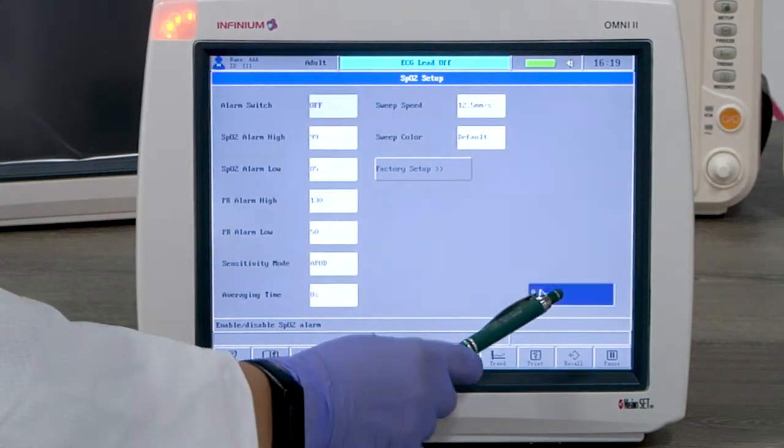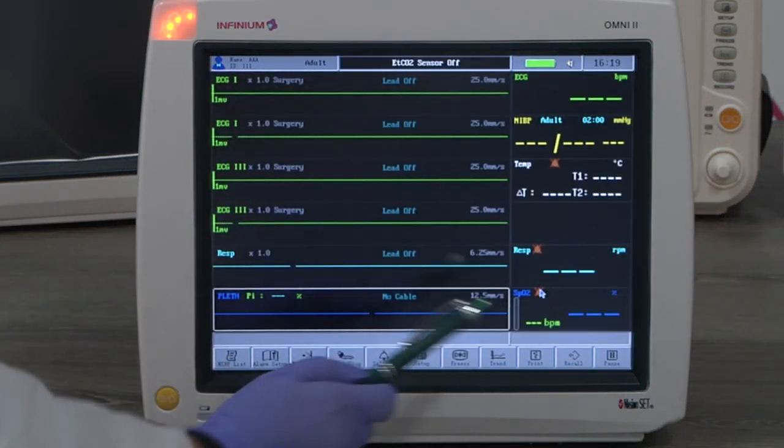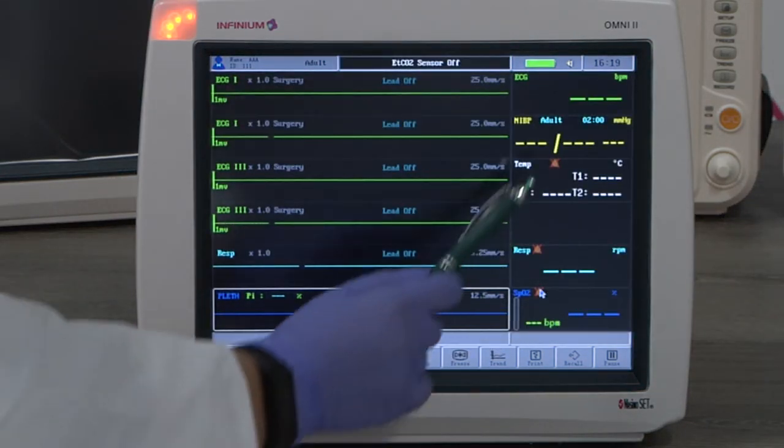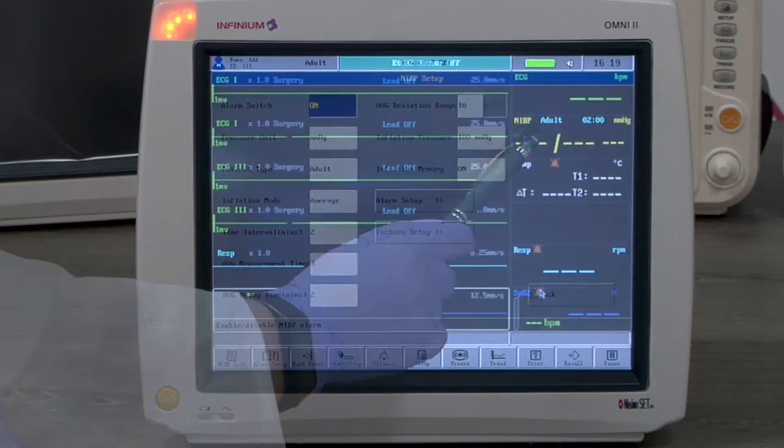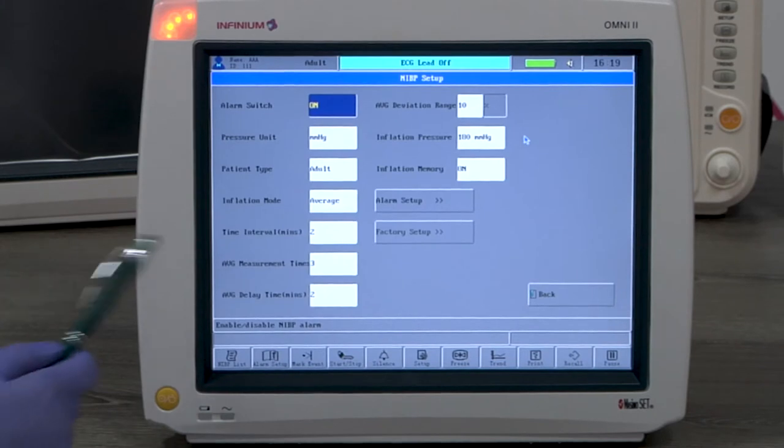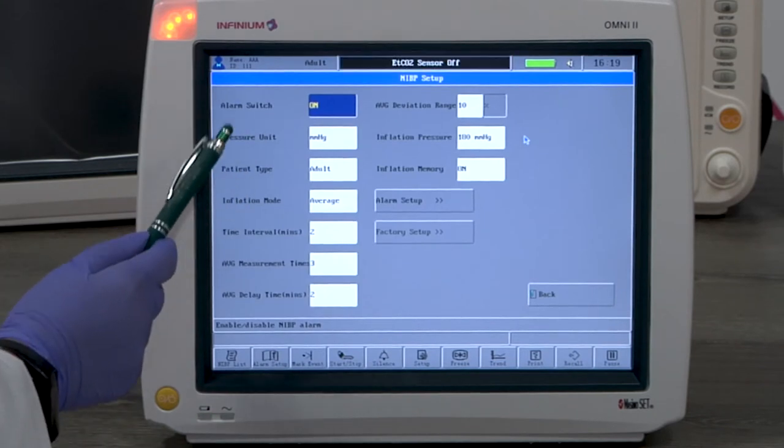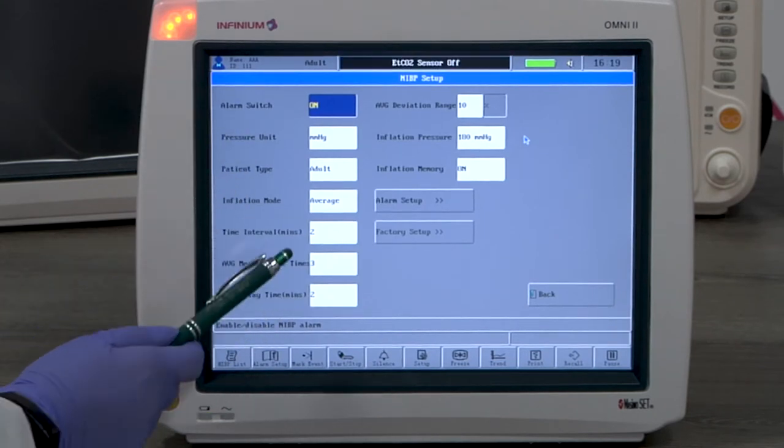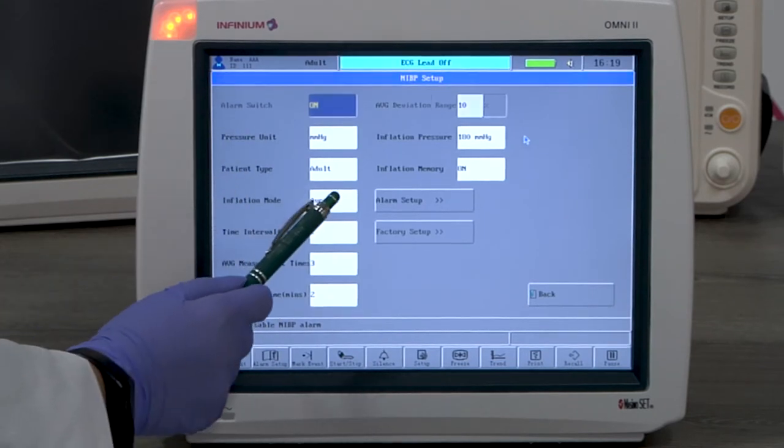Let's look at NIBP monitoring. By tapping on the NIBP window you will enter the NIBP menu. Here you can change all available settings to fit your needs.